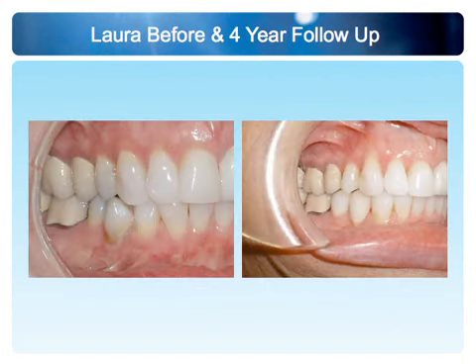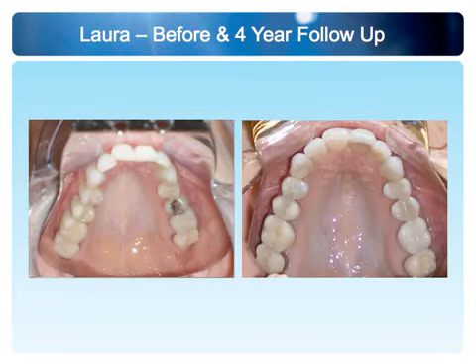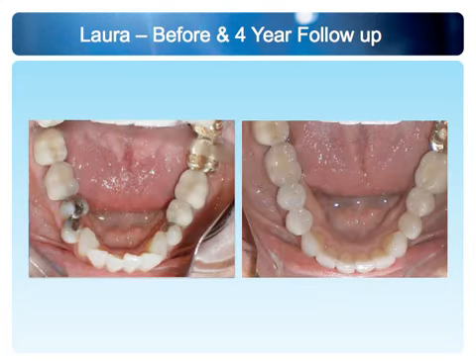And when we look at her class 1, it still exists on both sides. And our arch form holds the position because the occlusion is set up properly. It is not going to sink back in. So we are going to have that perfect arch form maintain itself. And over time, even the posterior molars, which were completely leaning in before we started uprighting them, are still upright. And that allows you to set up a nice arch form and unravel very good amounts of crowding and address everything, including the posterior teeth.